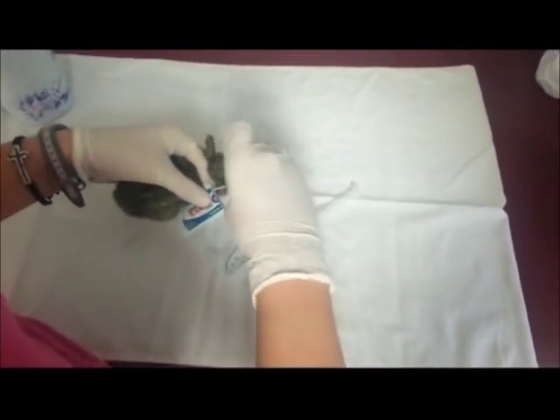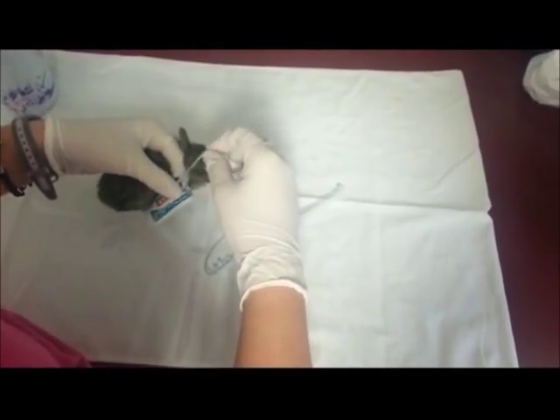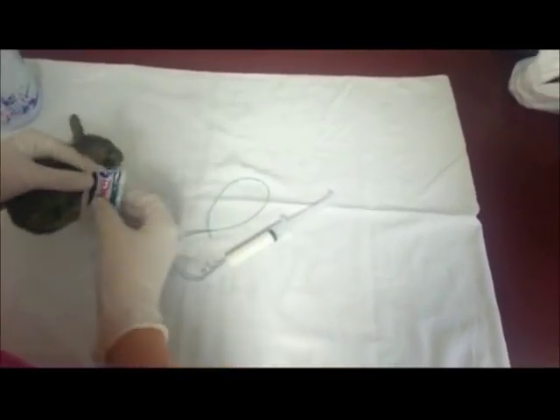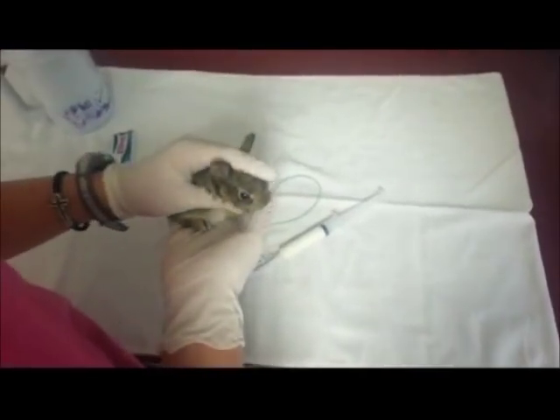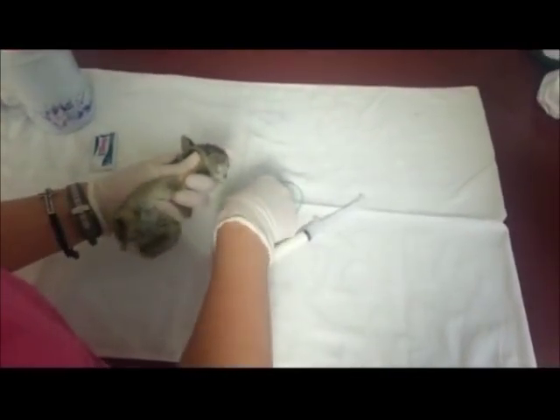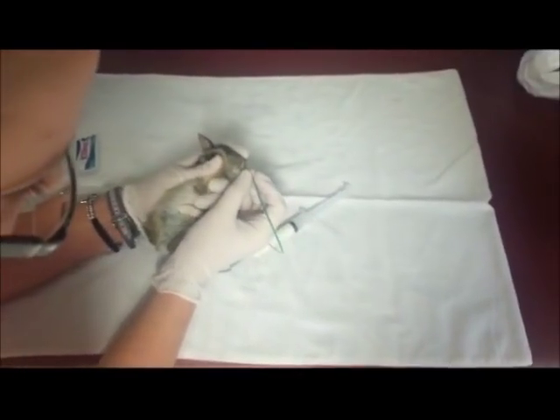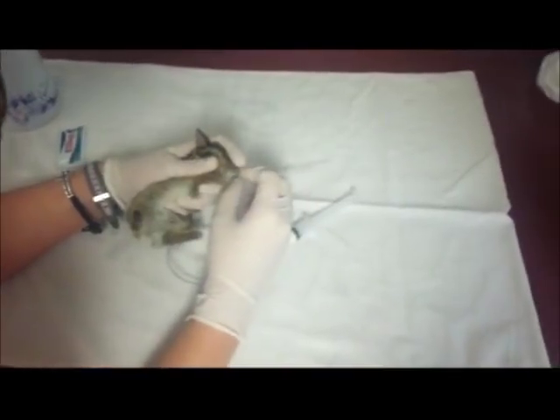Now, you're going to want to lubricate the end of the tube for less resistance while inserting the tube into the cottontail's esophagus. When you start, you want to go to the cottontail's left side to enter the esophagus and not the trachea. Gently start pushing the tube down till your mark. I like to put my fingers close to its mouth to ensure complete control.